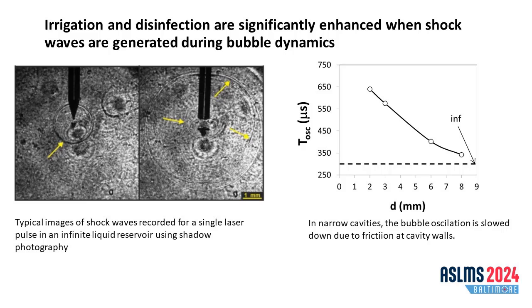In large reservoirs filled with fluid, this happens regularly. If we have short enough pulses and high enough absorption with, let's say, an erbium laser, you get shock wave formation.